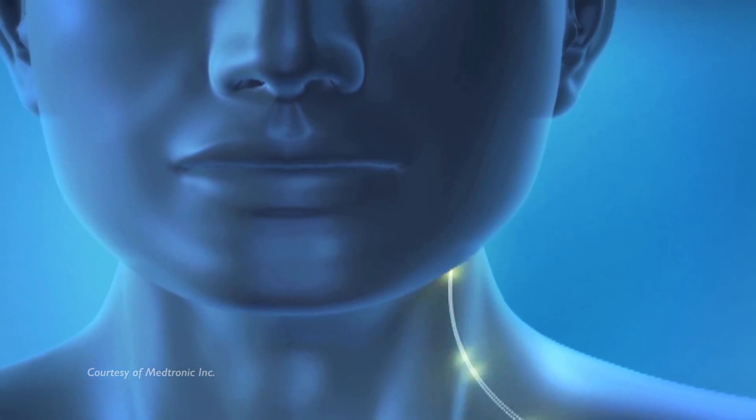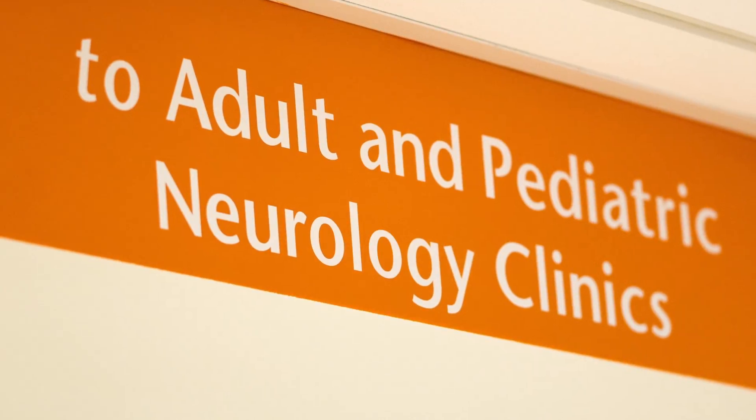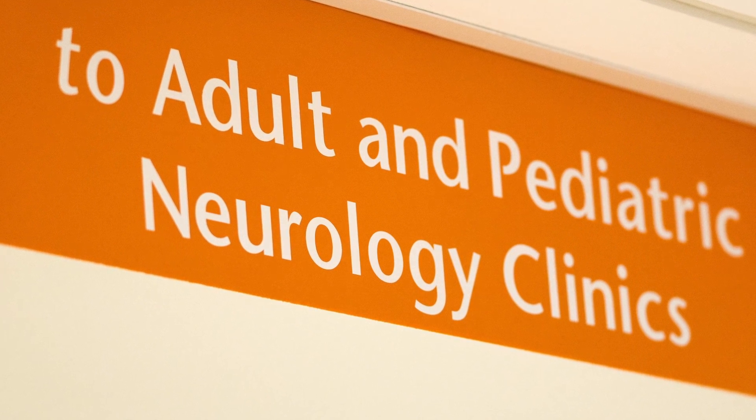Following Stage 3, the DBS system is left in the OFF position until you follow up with Neurology for programming.